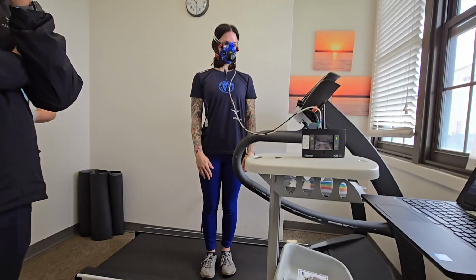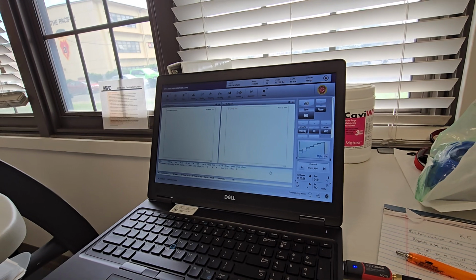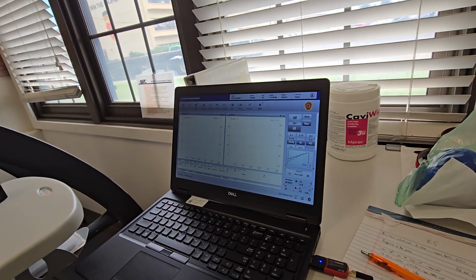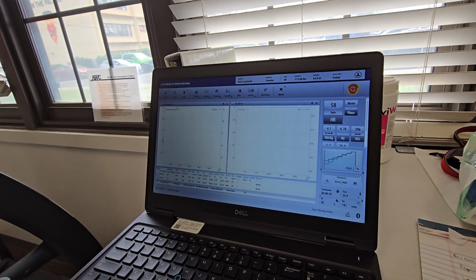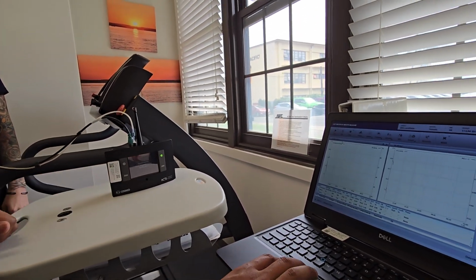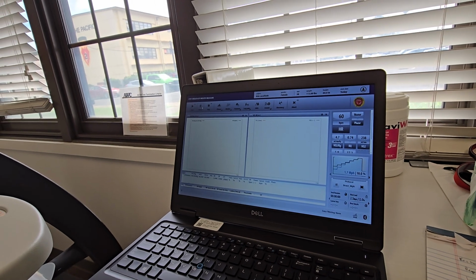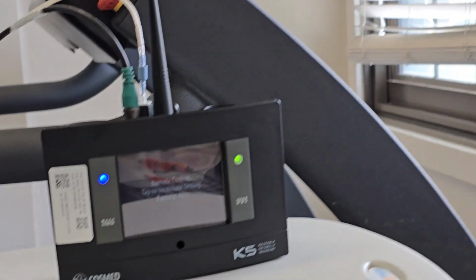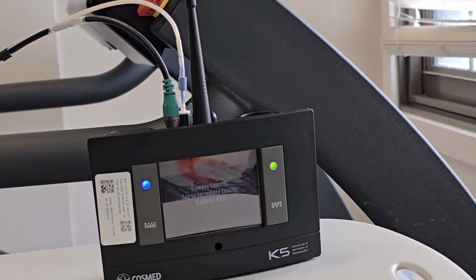Should already be done. I can wait the 2 minutes or go ahead and click record just so you guys see what the difference is. Okay, I'm going to go ahead and click record, and then notice this guy's going to turn solid blue once you start running the record button. So it'll wipe whatever's going on here, and it'll go into your protocol. Let's say you're connected to an ergometer right now, it would shoot the treadmill to whatever elevation or speed you're going to.